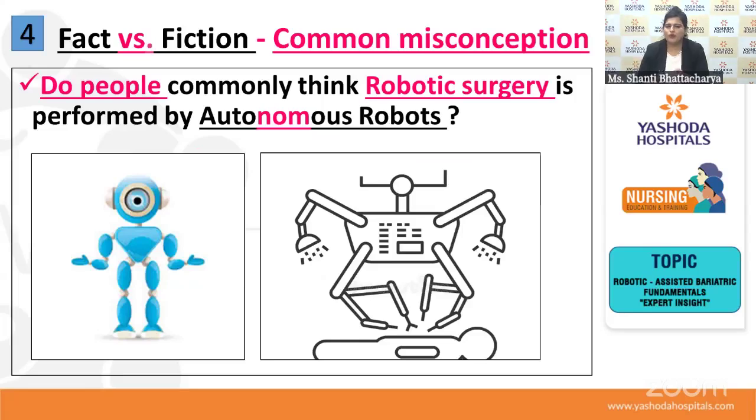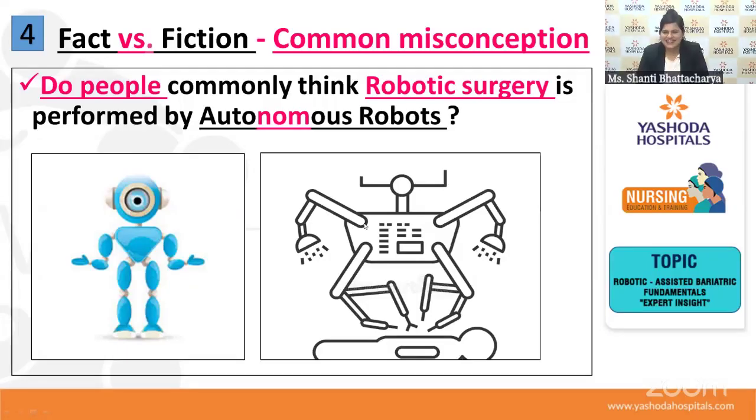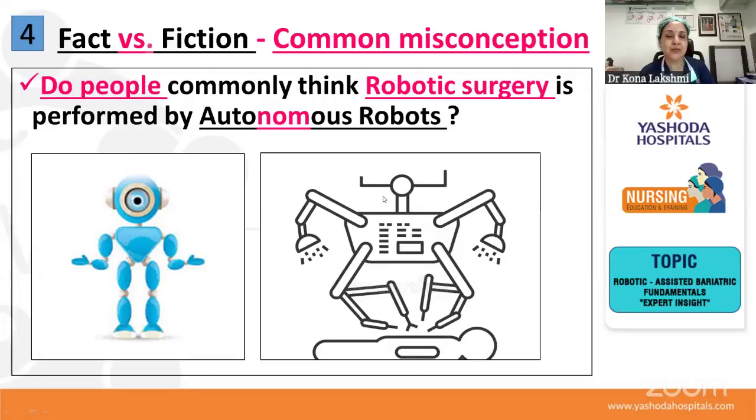Do people commonly think that robotic surgery is performed by autonomous robots? You may get to hear this, ma'am, when they come to you and you give them the option of surgical interventions. What do you hear? Yes, they say, no, machine, you only do our surgery, no? They say, why do you want to leave it to a machine to do? Then we say it is not letting a machine do it while I sit in my OP.